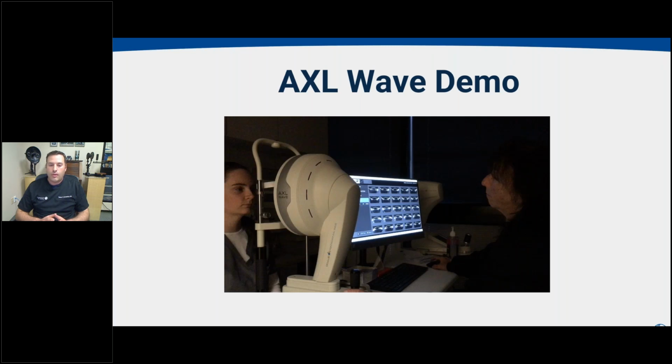So that video took about 1 minute and 15 seconds, which was the real time of getting an analysis of one eye. I will tell you that our Pentacam is connected to a server, which actually probably slows it down just slightly. So if you have it standing alone, it might work even a little bit faster. But essentially, to get the measurements that you would normally get from multiple devices, which would require you to bring your patient from room to room, type in their information multiple times, move them from device to device, 1 minute and 15 seconds to 1 minute and 20 seconds to capture one eye is a pretty streamlined way of getting pretty much all the data you need for the anterior segment.